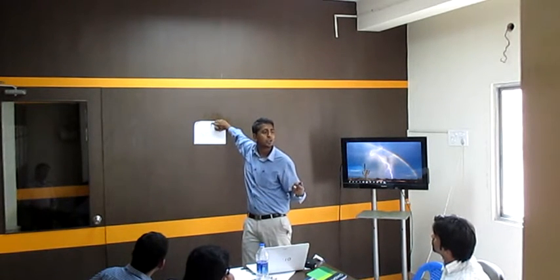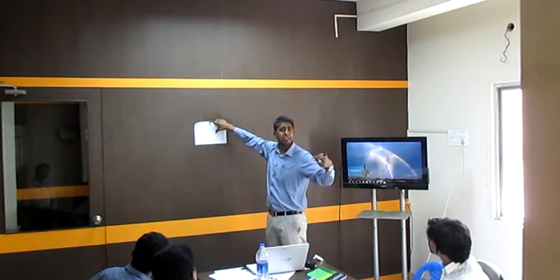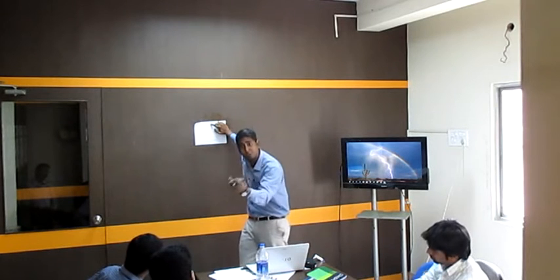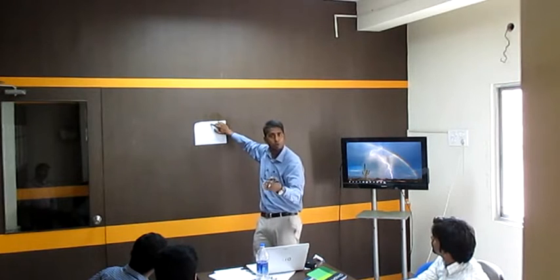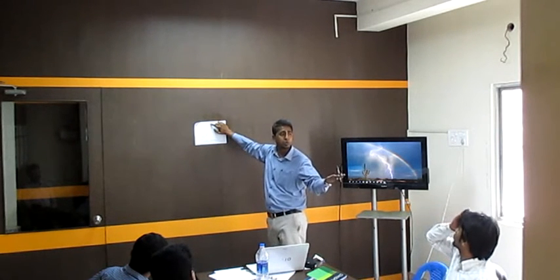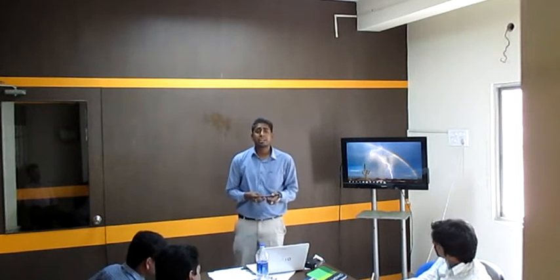So what do you require? You require an increasing ratio handpiece. And which one do you require? 1:4. So what is the purpose of having ratio handpieces? Increasing is to go beyond the maximum speed of the micromotor, and decreasing is to go below the minimum speed of your micromotor. If you want to go below the minimum speed of your micromotor, you will use the decreasing one. If you want to go beyond the maximum speed, you will use the increasing one. Clear?